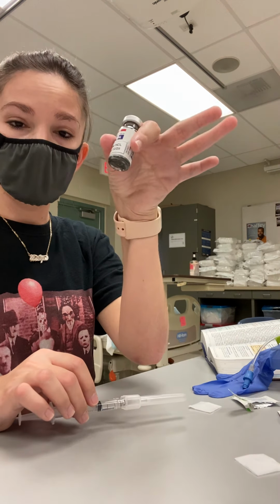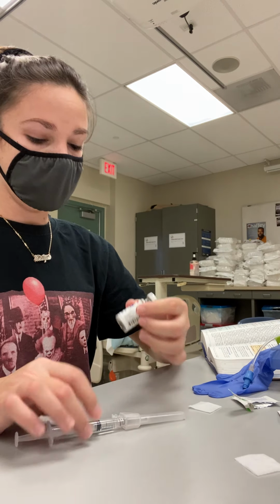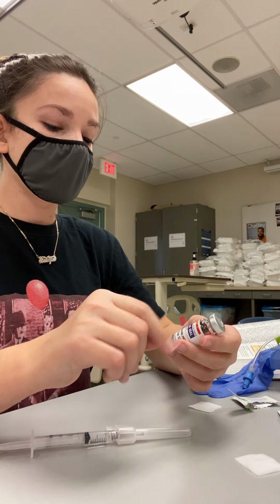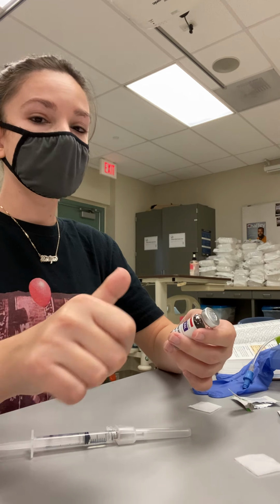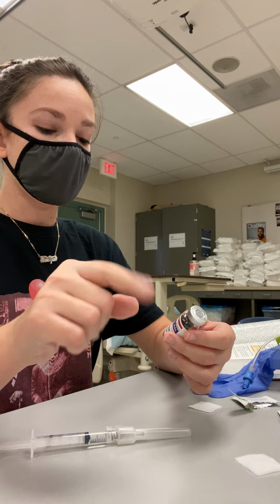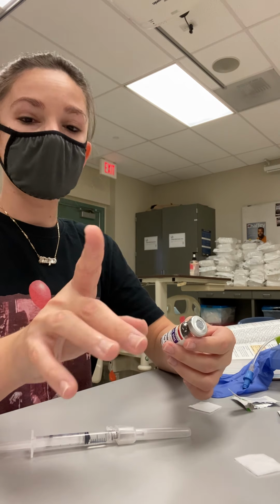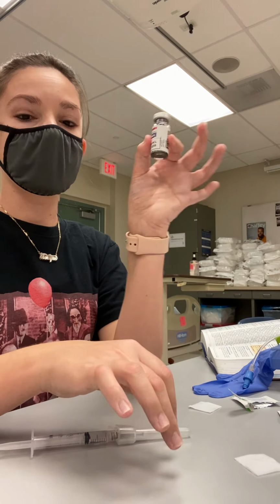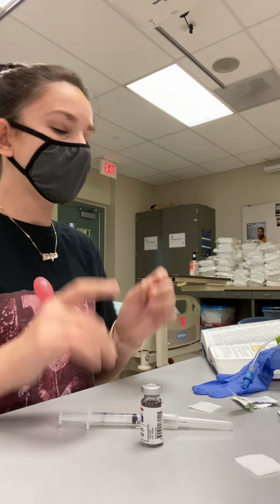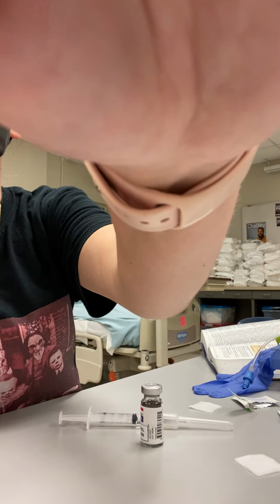You will take this with you to the computer because you will need to scan the medication. So you'll do your check: it'll be metoclopramide, right patient, 5 milligrams, and the vial is not expired. So that's your second check. Then now you'll do hand hygiene.